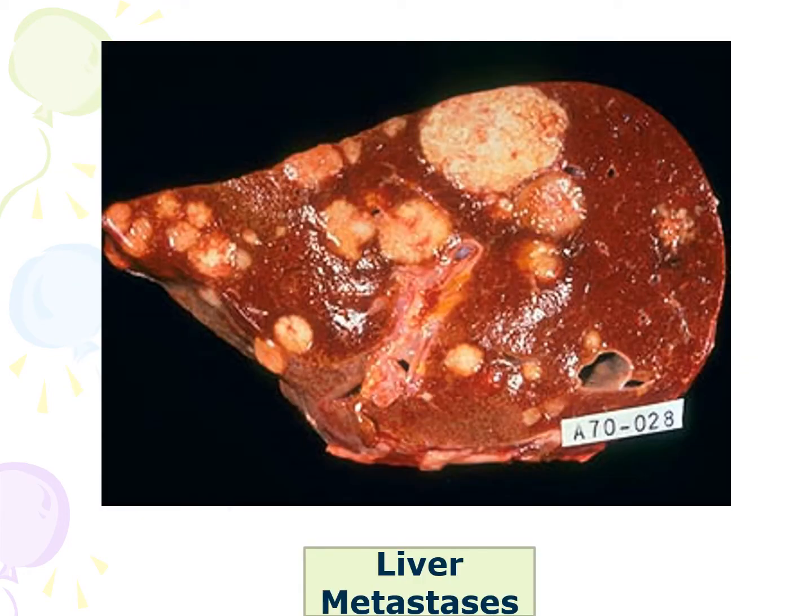This is a metastatic colorectal carcinoma in the liver. Note the numerous mass lesions that are of variable size. Some of the large ones demonstrate central necrosis. The obstruction from such masses may elevate alkaline phosphatase, but not all bile ducts are obstructed, so hyperbilirubinemia is typically not present. The transaminases are usually not greatly elevated.